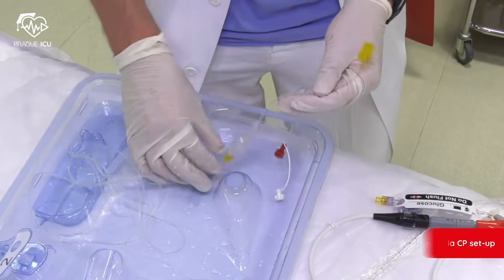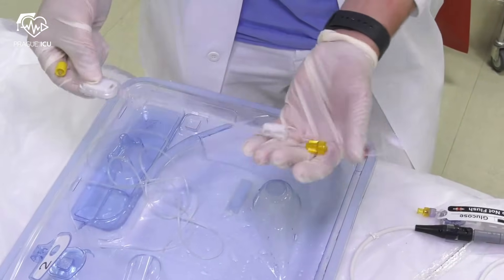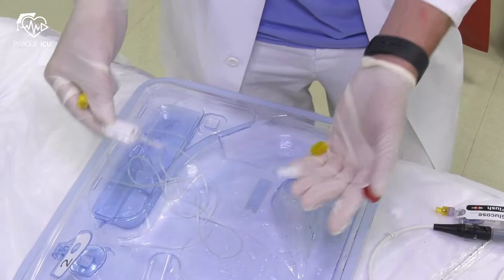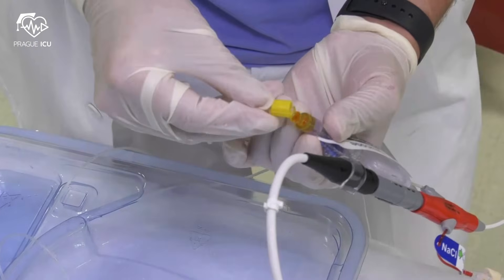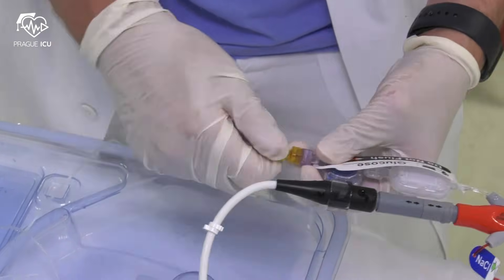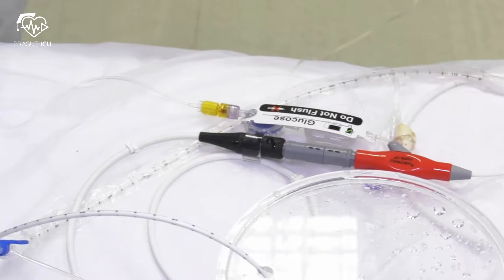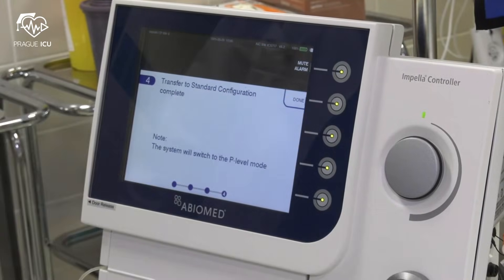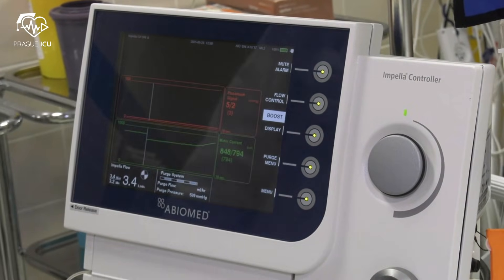Push next and remove the Y connector, then connect the yellow luer to the Impella catheter. Discard the Y connector. Connect yellow to yellow luer — wet-to-wet connection. Press next. Transfer to standard configuration is completed and the icon has disappeared.